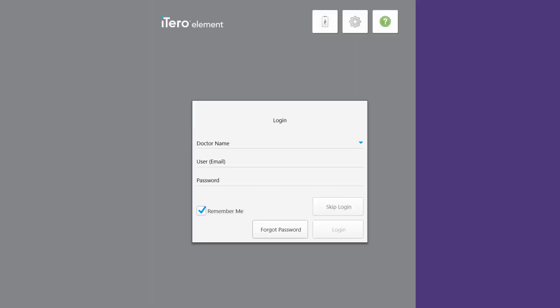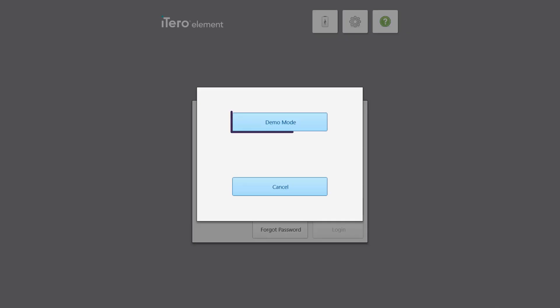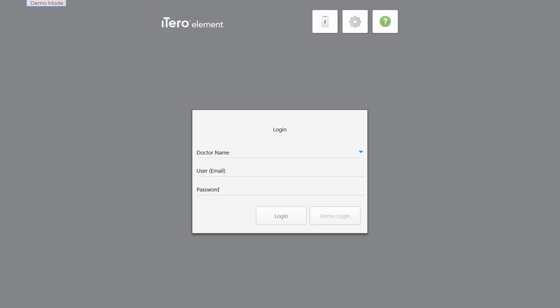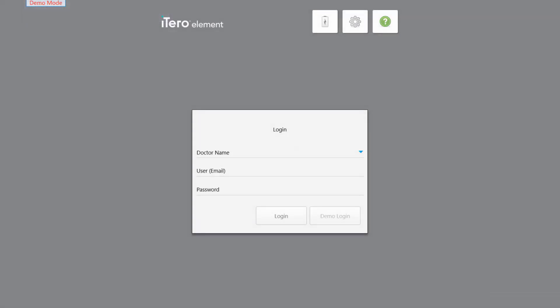To access demo mode, tap the iTero element icon and tap demo mode. Note the demo mode caption which indicates that the scanner is in demo mode and any scans made cannot be submitted or exported.